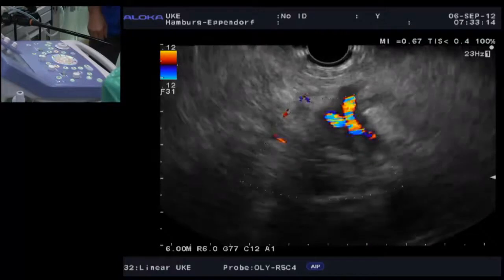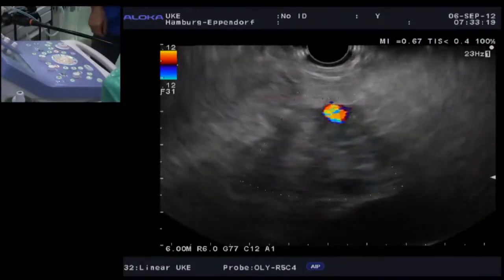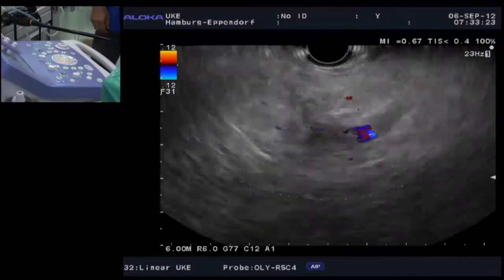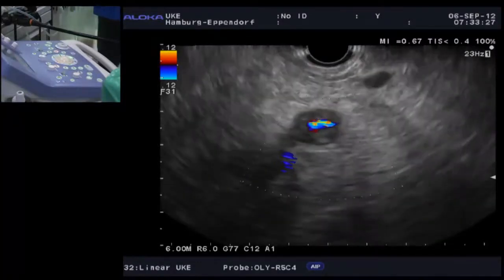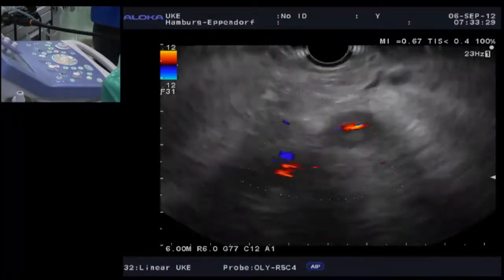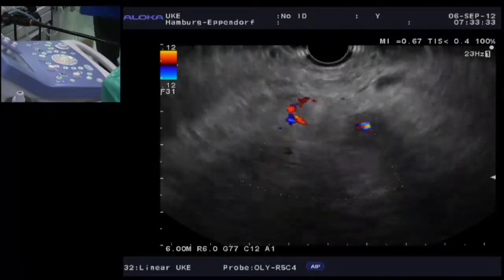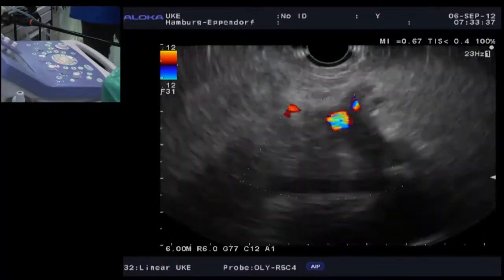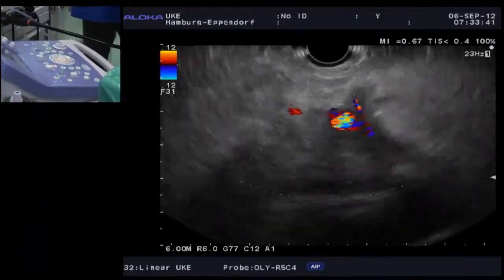And when you remember the CT finding of this patient, there is a clear low attenuation area, an enlarged area in the pancreas head and around the celiac axis. Did you have any enhanced CT scan here? Because CT finding will give a better image, I think. Yeah. I only have the static images that were presented in the case, Dong-Wan. I didn't have anything more.